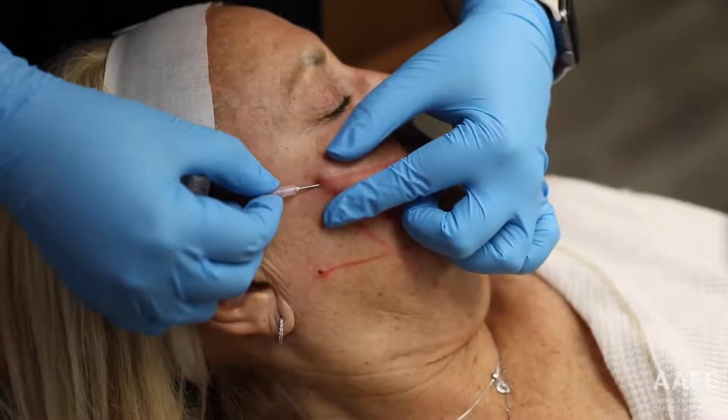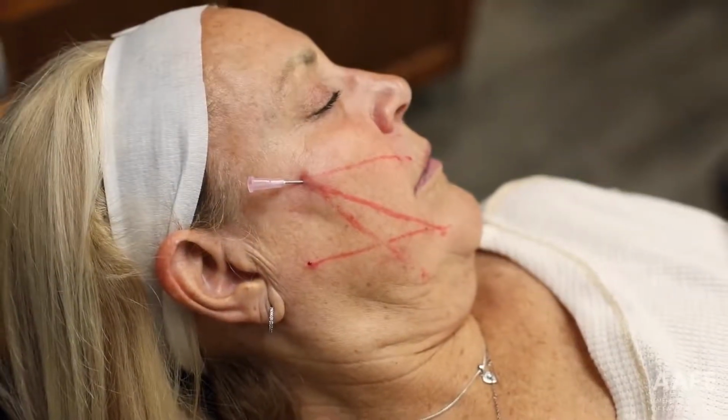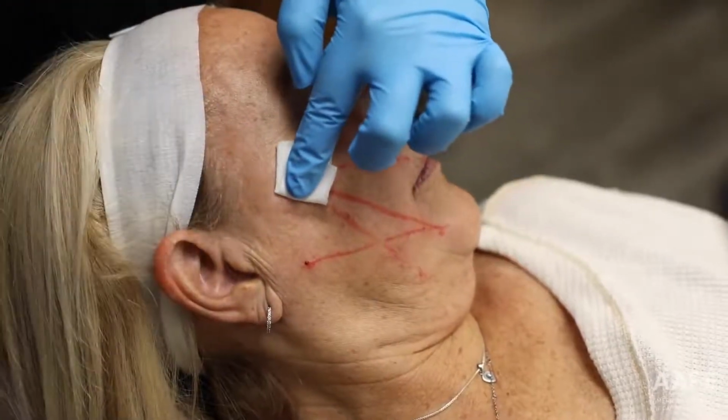How does that feel, Terry? Pretty good? All right, let me just get a piece of gauze because bleeding is inevitable in this procedure.